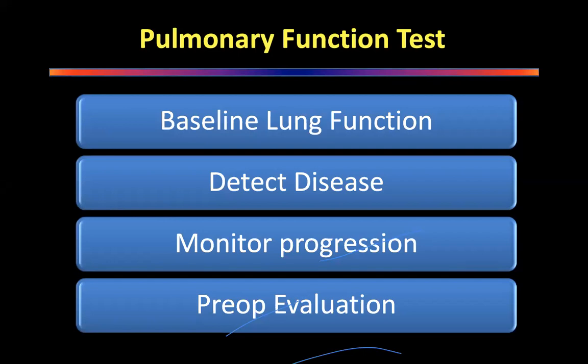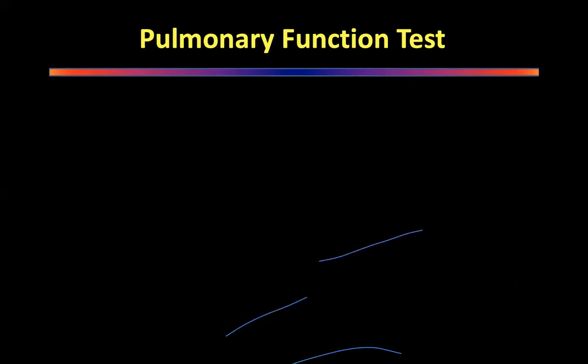And of course, as surgeons, we use PFTs for preoperative evaluation. One thing I forgot to say here is sometimes PFTs are used as a medico-legal tool. So you document the PFTs and then you use it to help in your medico-legal cases, or when people go for claiming for asbestos and things like that, asbestos exposure for occupational disease and all. A baseline PFT actually helps in those medico-legal cases. So it is one more reason why you would do a PFT.